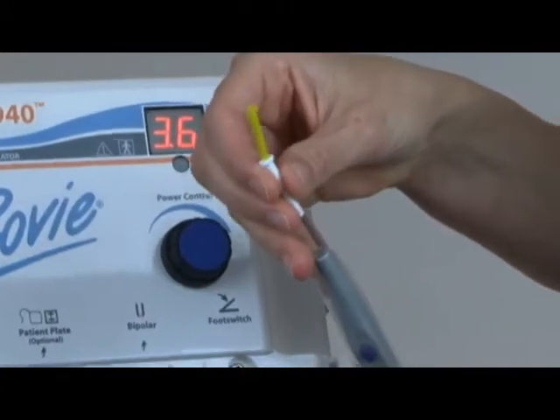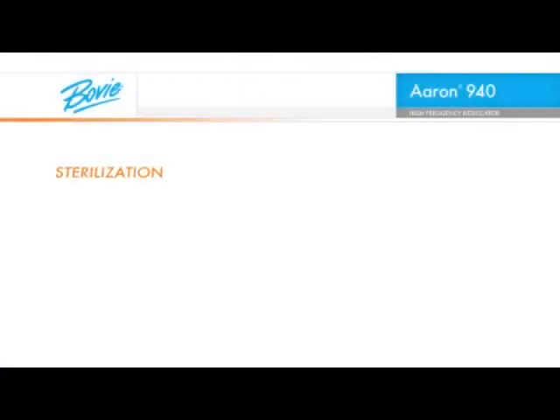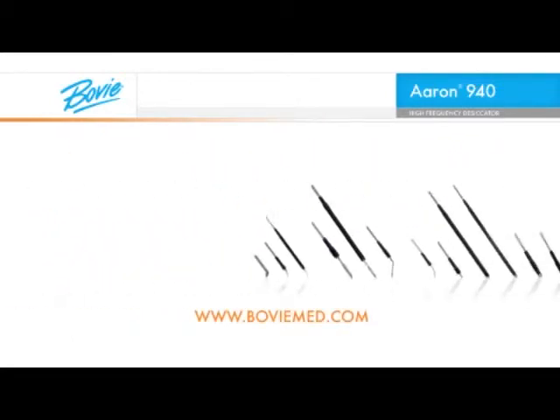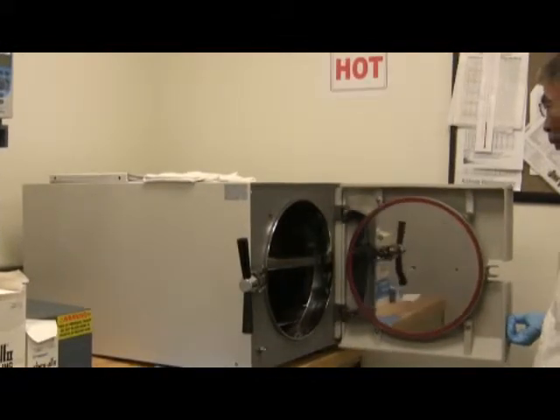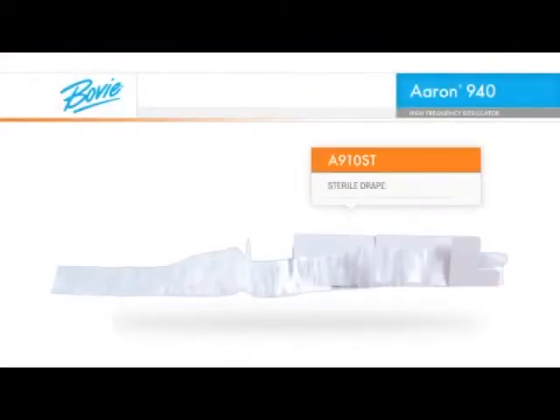We recommend you use disposable electrodes for each patient procedure to avoid cross-contamination. If you prefer to use reusable electrodes, sterilize the electrodes at the setting recommended by your sterilizer's manufacturer. A full selection of disposable and reusable electrodes is available from Bovee Medical Corporation. If handpiece sterility is required or if a handpiece should become contaminated during a procedure, then steam sterilization is the recommended method, or the Bovee A910ST sterile drape can be used as a convenient alternative.